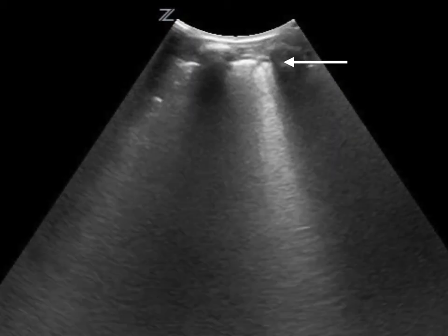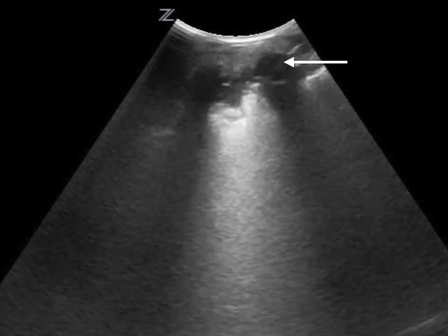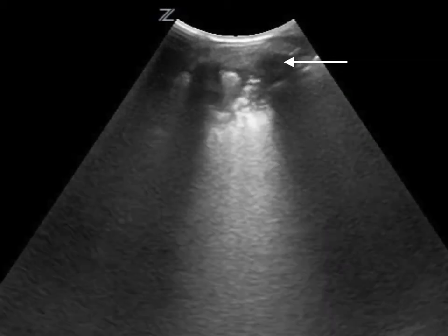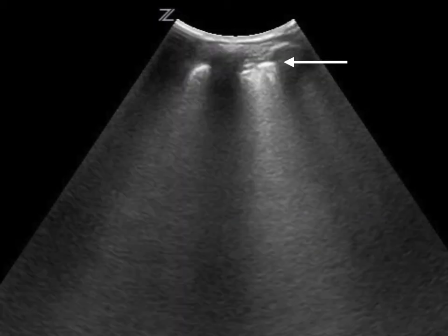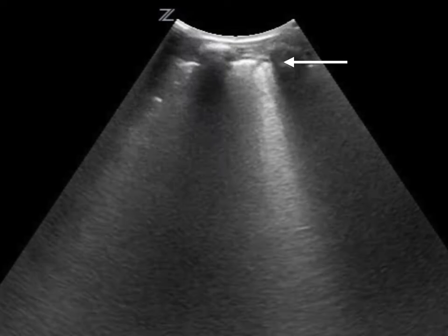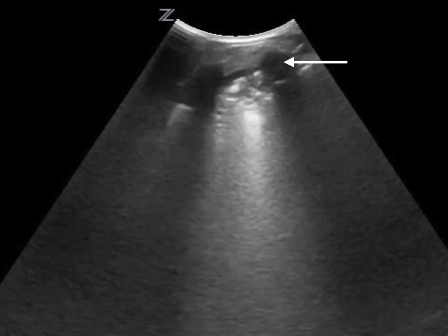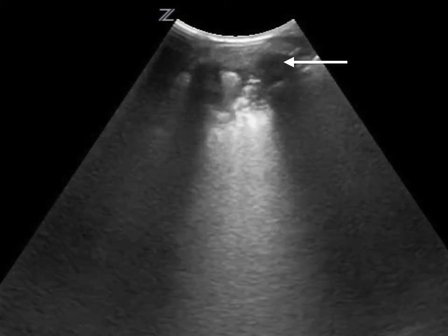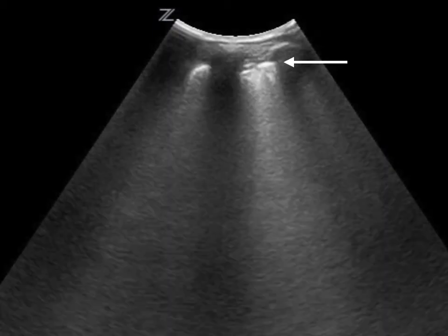What do you think about this case? I think the answer is no. I don't think that this is a crisp pleural line. I think it's irregular and there's something going on there. It's going to be for one of two reasons. The first reason would be that my angle's off, which is something that we talked about at the beginning of this lecture. So I might need to tilt side to side to confirm that I am as perpendicular as I can be. If that's not the case, then what I am starting to see is either inflammation or infection right at this pleural line where the visceral and parietal pleura are meeting.